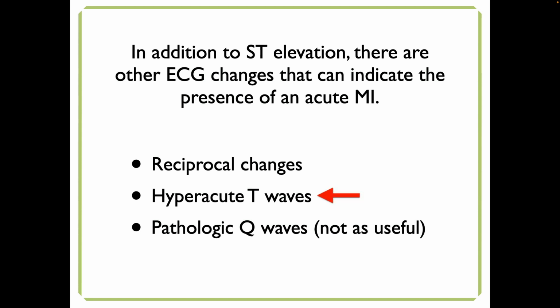So, again, the whole point of this slide is to talk about further evidence for STEMI besides ST elevation. We've already talked about reciprocal changes, so now we're going to talk about something called hyperacute T waves. All right, trick question, although not really if you remember medical terminology.